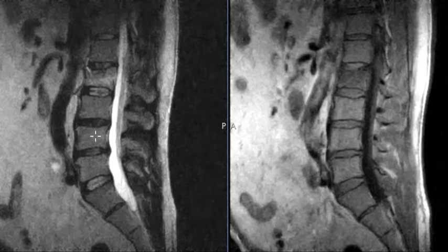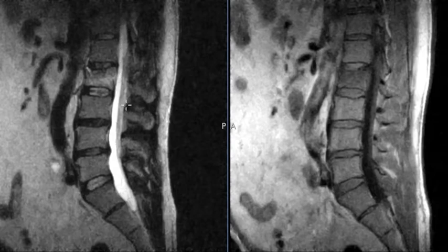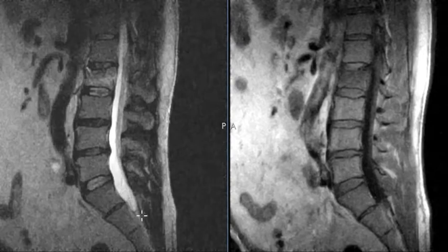This is the left image, called a T2 image. We know it's T2 because T2 has fluid which is bright, or hyper-intense as we call it. This is that fluid in the spinal canal. We see the fat is also pretty bright, and the bones are kind of gray.